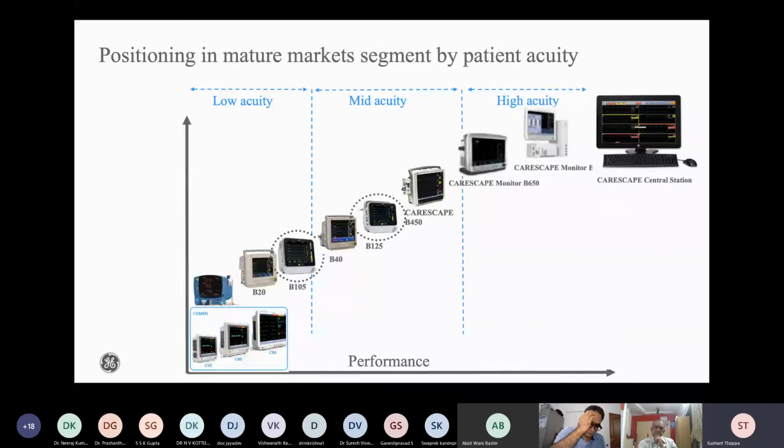And you add stuff like EEGs and all those parameters. And then finally, when you combine all of these together in any care setting, you get what is known as central monitoring. Once the central monitoring is set up, you connect other things into it. You connect your lab systems, you connect your PAC systems, and create a much larger, more intelligent system.